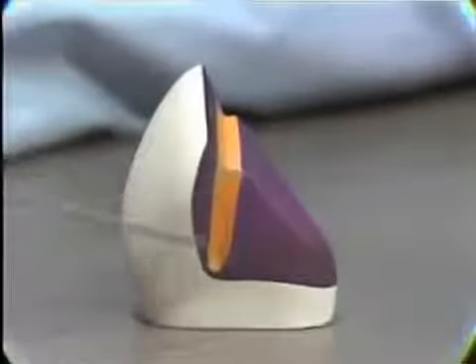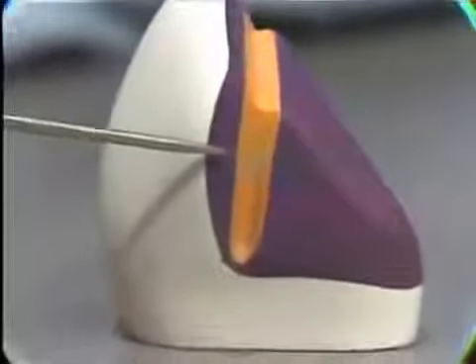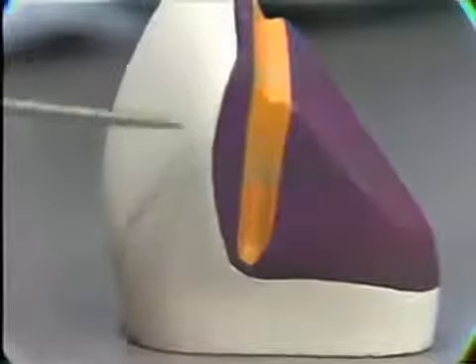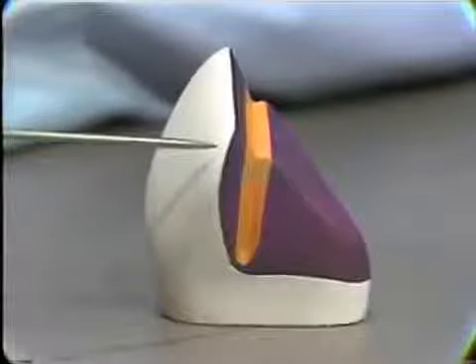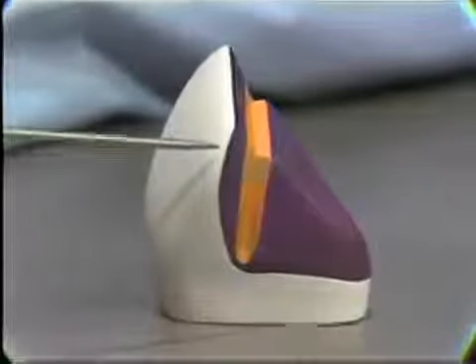Now you can see that in order to get the necessary retention, these grooves have to be of adequate length, they have to be on the proximal surface, and they do to some degree determine the extent of the slice that must be made. And in many situations, having to put a groove here will lead to bringing the gold further forward in this region than you would really like from an aesthetic point of view. And this is one of the great advantages of the pin ledge preparation.